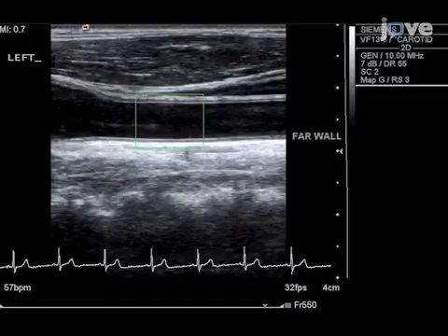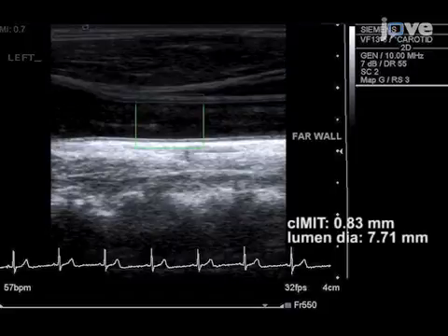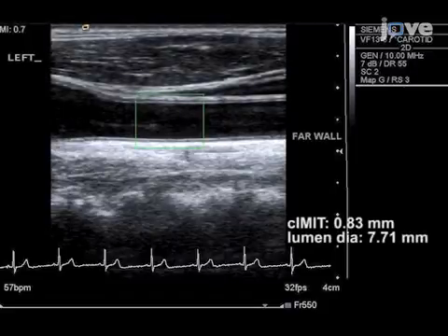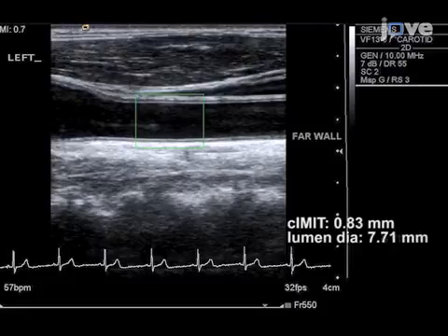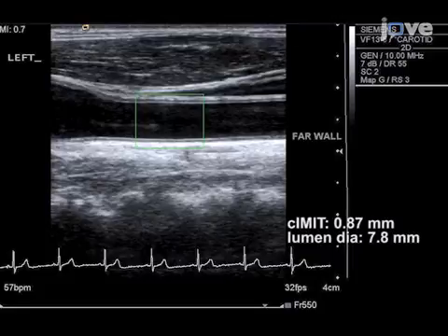Carotid intima-media thickness was looked at in the left carotid artery of a healthy individual. The CIMT value for the far wall was 0.83 mm and the lumen diameter was 7.71 mm. The same measurements on the right carotid artery were 0.87 mm and 7.8 mm.